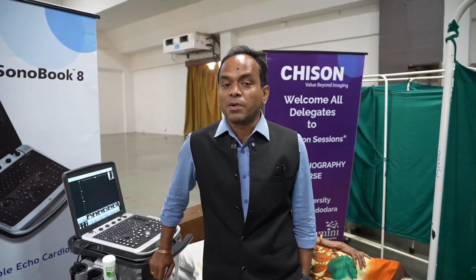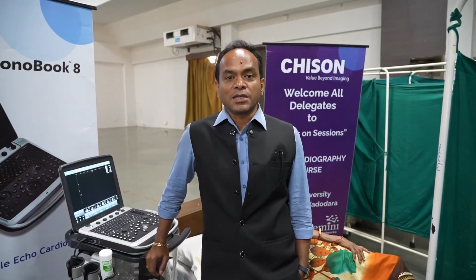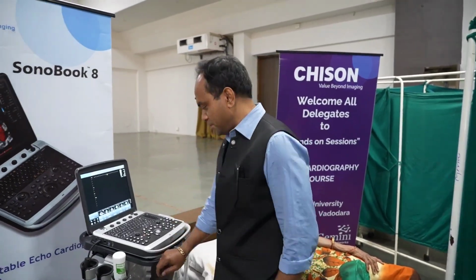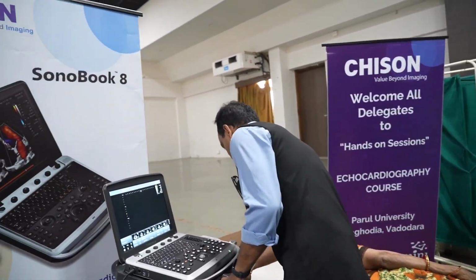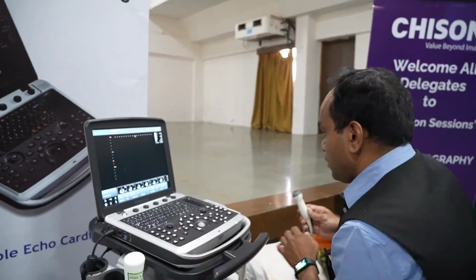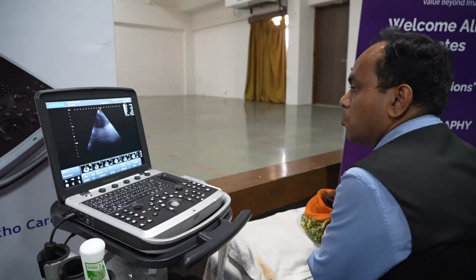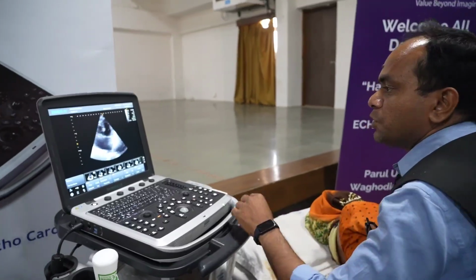So we have this female patient who presented to us with marked breathlessness, although she is okay now, but I just wanted to show you some glimpses of her echocardiographic features that reveal that she has a significant mitral regurgitation. So let us straight away jump to the echocardiographic features. So I will directly go to the 4-chamber view of this patient.